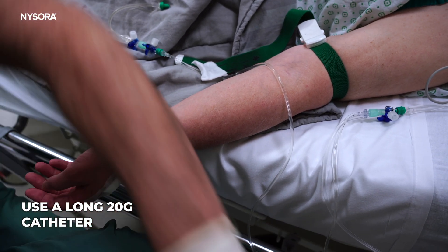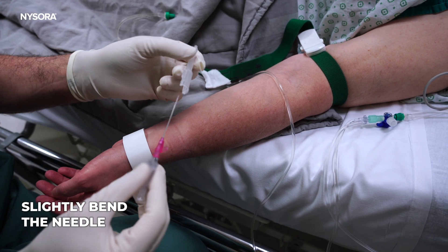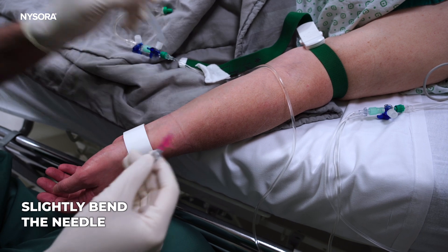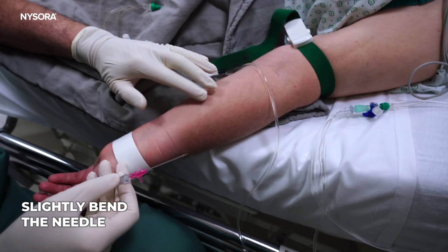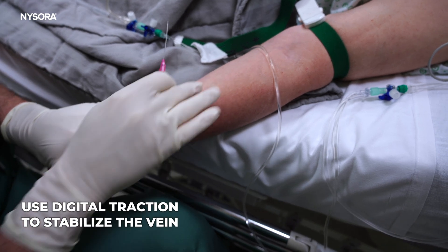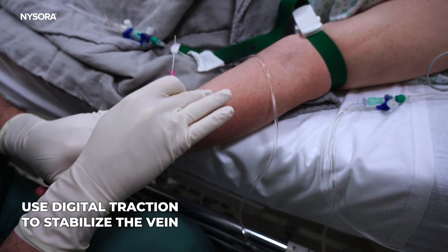We're going to take a longer catheter and we're going to also slightly bend it, which would allow us to lift the needle tip up as necessary. I'm palpating the vein and I'm going to fix the vein with a little digital traction here.